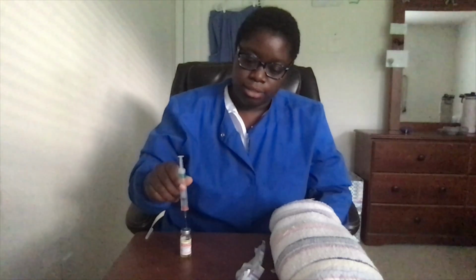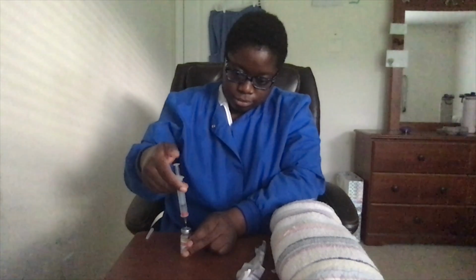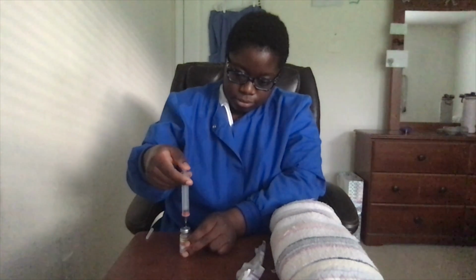There's only half a milliliter of fluid in this vial, so I will not be able to pull back in case of air bubbles. So I will simply have to flick them out. The plunger is at the half a milliliter level. And now I'm going to depress the air into the vial. The syringe is at eye level. There is a bubble present, so I'm knocking it out.